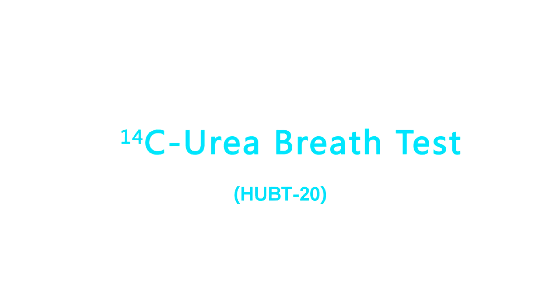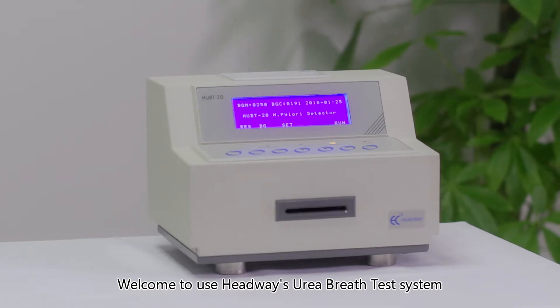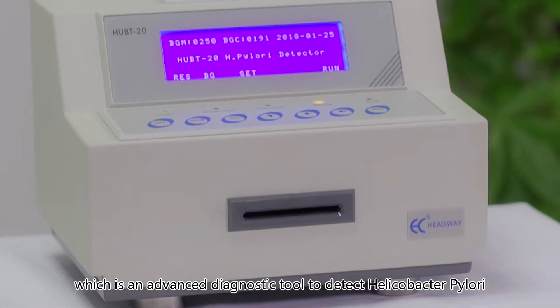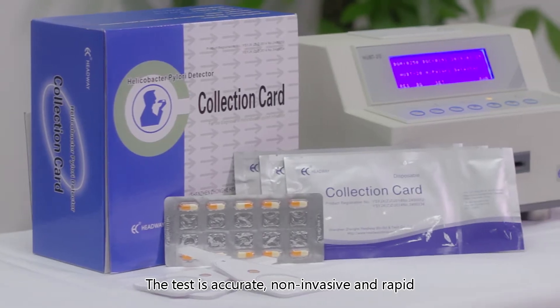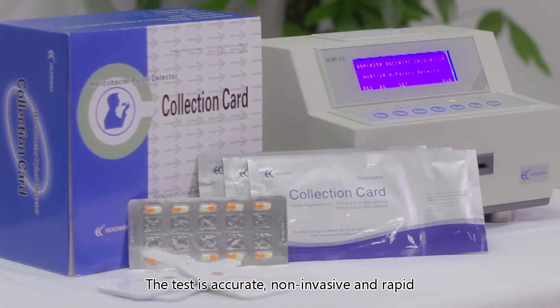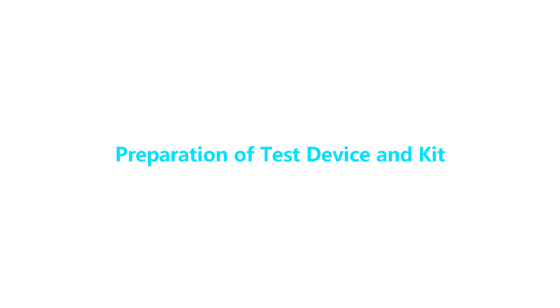Welcome to Headway's Urea Breath Test system — the UBT 20 — which is an advanced diagnostic tool to detect Helicobacter pylori. The test is accurate, non-invasive, and rapid. This is how it works.